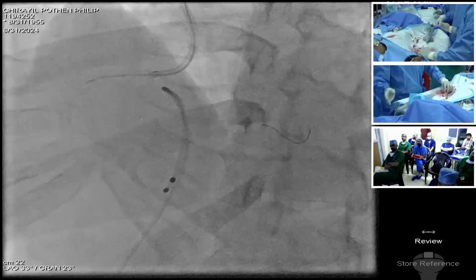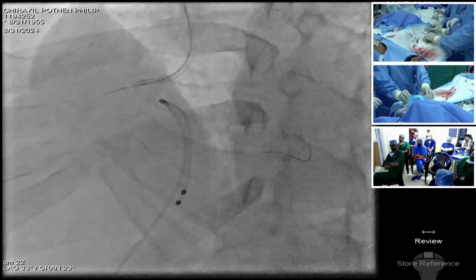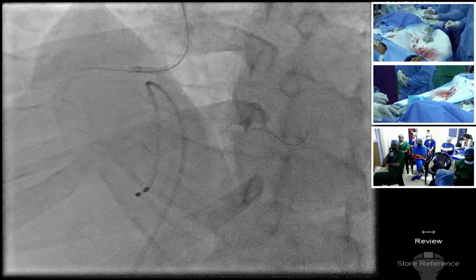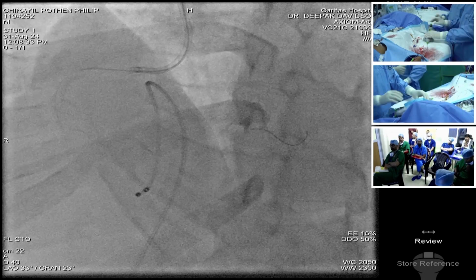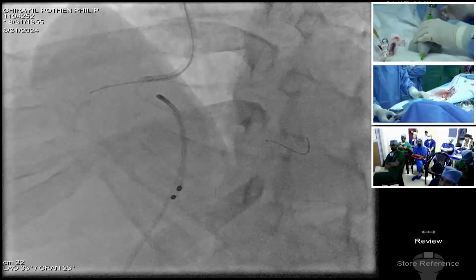Okay, now we are closer to the lesion, it seems. We can unlock. We've unlocked it and moved it a little bit forward and backward, something like releasing the tension. Sir, please go ahead. Can we start that one? Now we have kept it at 80,000 RPM. Okay, we can start. Now you see.